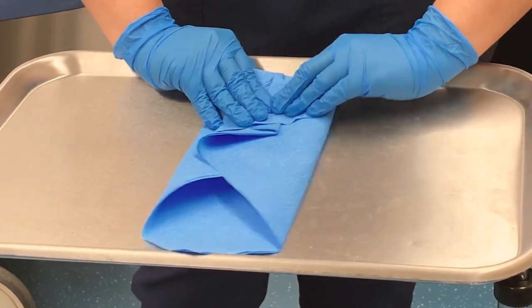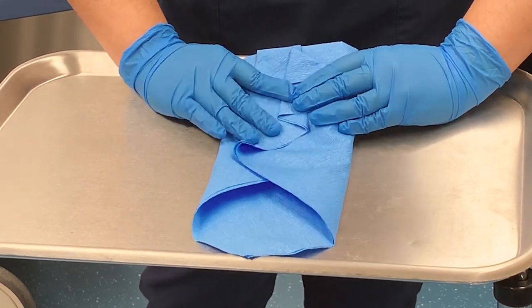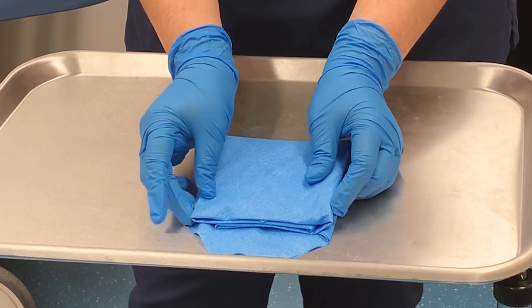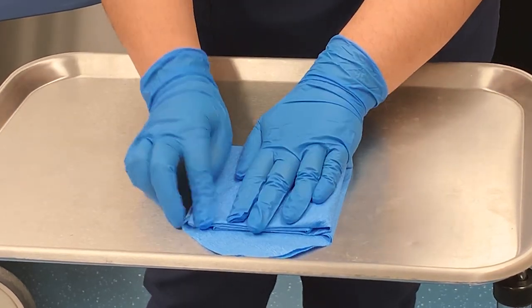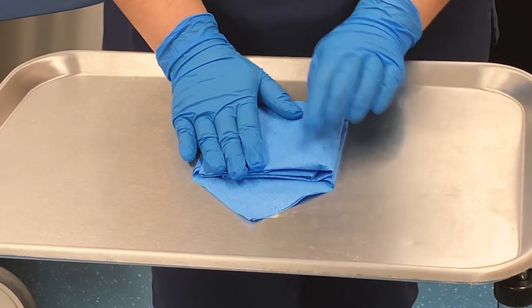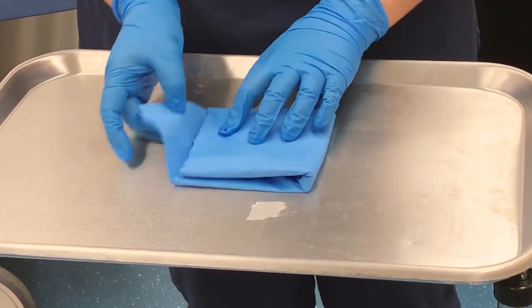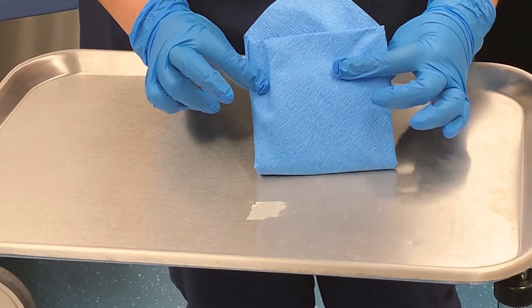Next, you're going to grab the instruments and fold them over themselves — like so. You should have a nice little square or rectangle, depending on the shapes of your instruments. And now you see we have a little tab, and this looks like a little envelope.